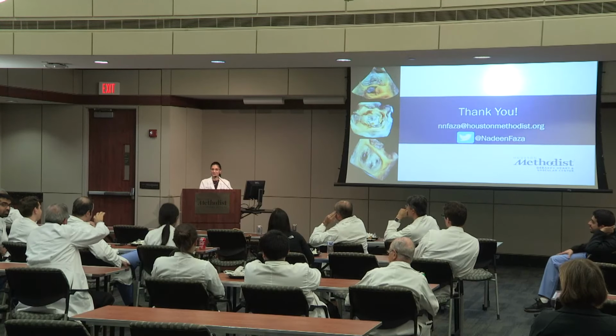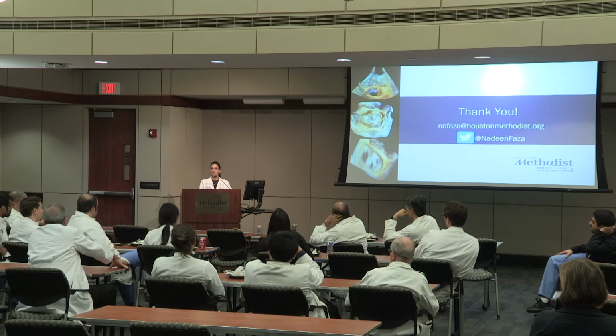I think it shows you the location, the extent. So again, when you're in the middle of the case, with the interventional cardiologist asking you, how good does this look? Are you relying more on 3D or 2D? Both. But I would say 3D for localization, 2D for quantification for now.